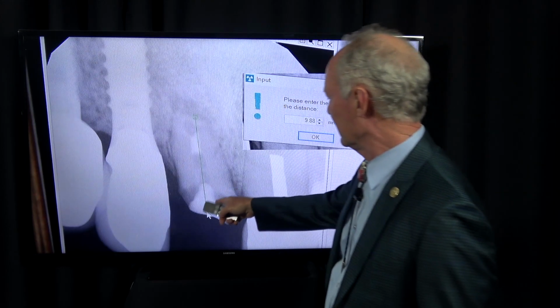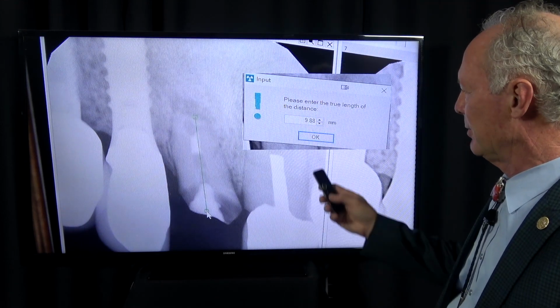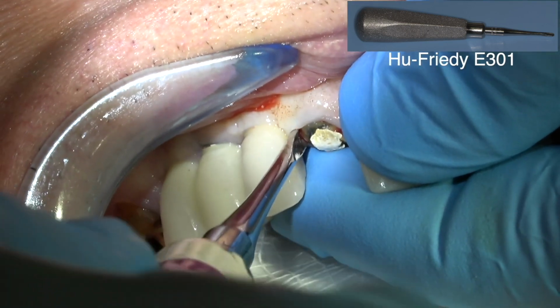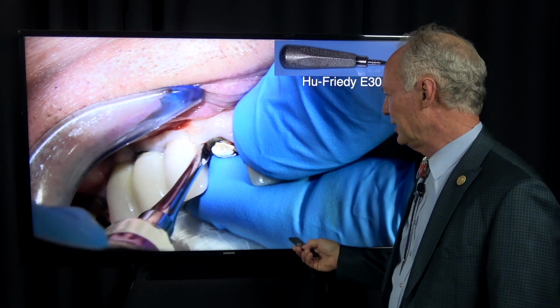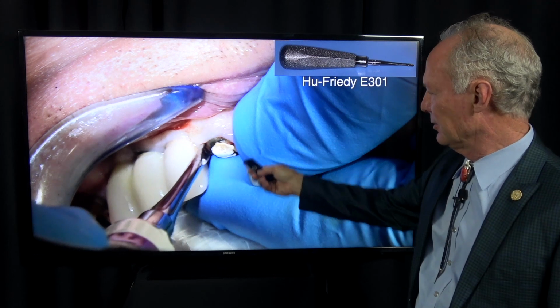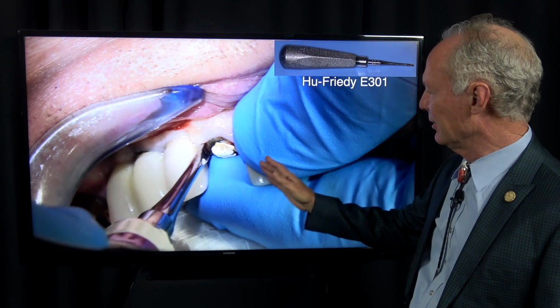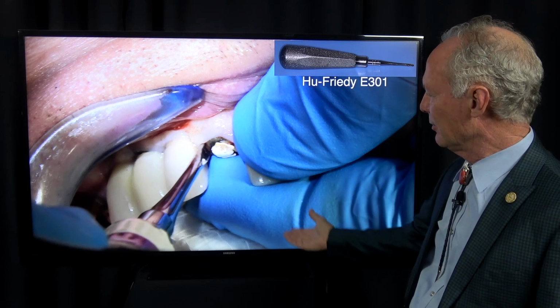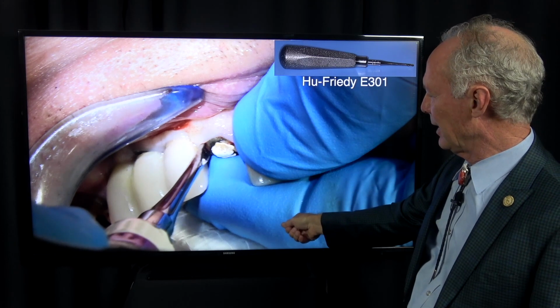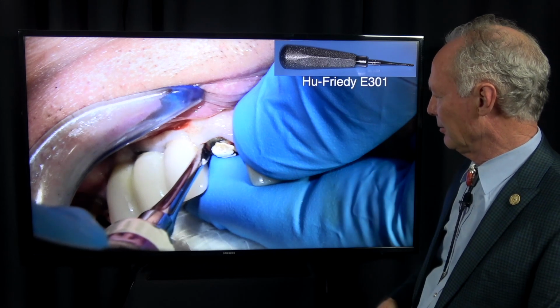So I'm measuring the length of the tooth to the apex just because I know how deep the socket is before I use the Easy Extract. Now, a great way to use the Easy Extract, if you can get some horizontal movement on the tooth, mesial to distal, with a 301 Hu-Friedy or some other instrument, that's nice to kind of loosen it up a little bit. Now, you don't want to move it with a forceps facially or palatally, because you want to preserve that facial bone and the palatal bone for the implant.